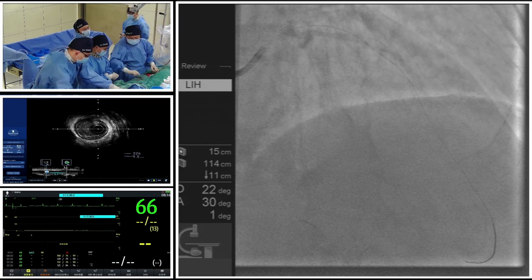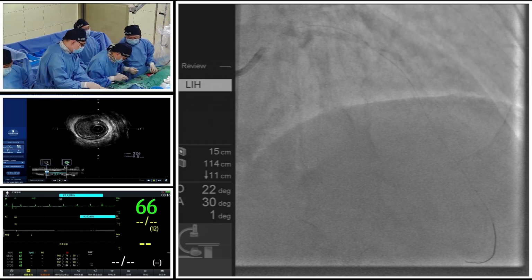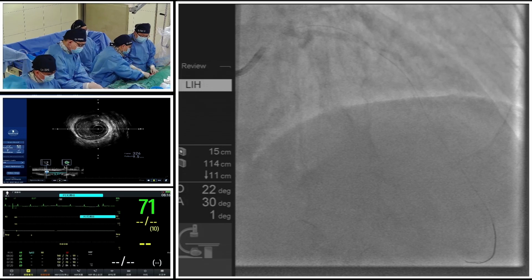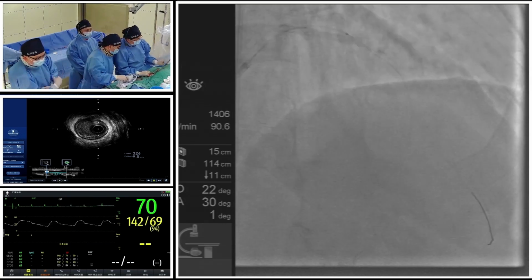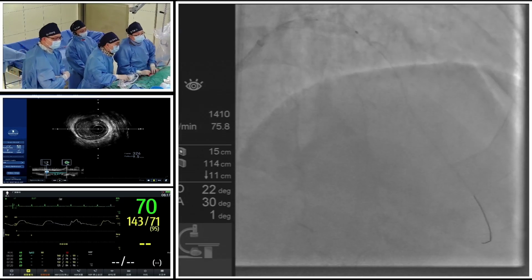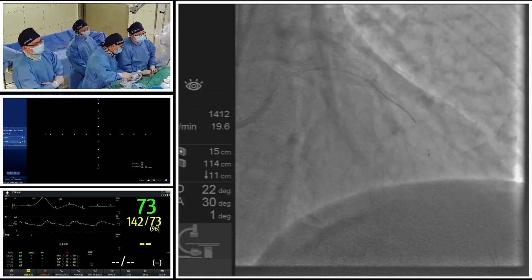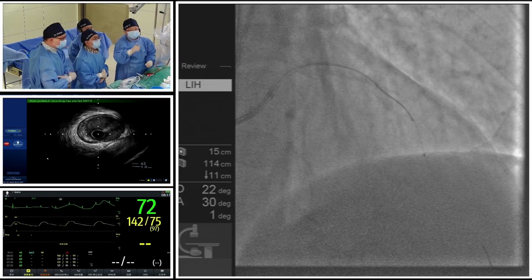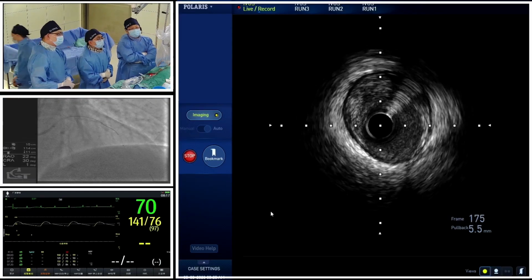So I think that under the guidance of intravascular imaging, complete revascularization for this patient could also be a great choice. It is what we are doing because the CABG was declined by the patient. We know that calcification is associated with a high prevalence. According to the previous manuscript, we understand that over 50% of the procedures are associated with calcification. Now, let's ask the audience to look at the IVUS. Okay, so we are pulling back from the LAD.